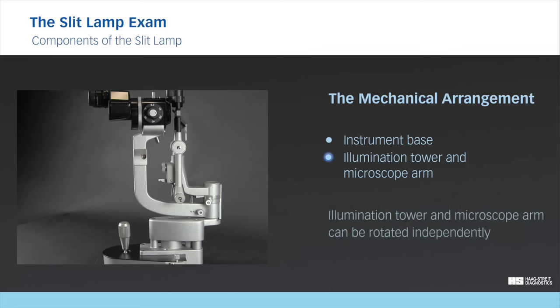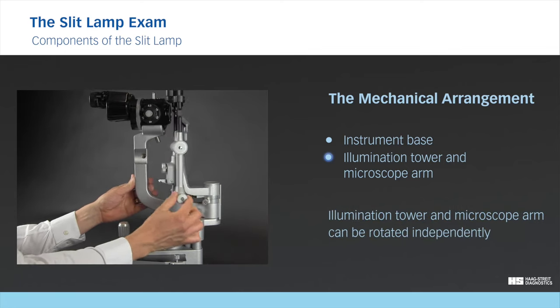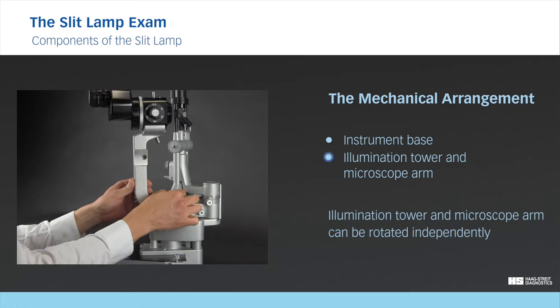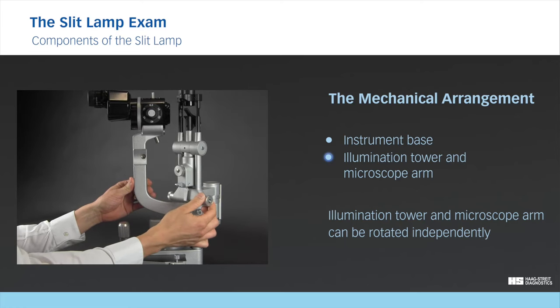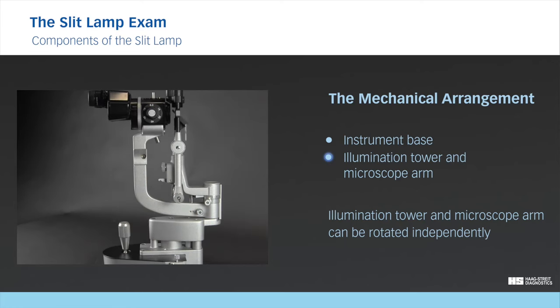During the slit lamp examination, the illumination tower and the microscope arm are moved independently of one another. The microscope arm is most frequently positioned directly in front of the eye, while the illumination tower is typically rotated to the user's left or right to illuminate the ocular structures from an angle.